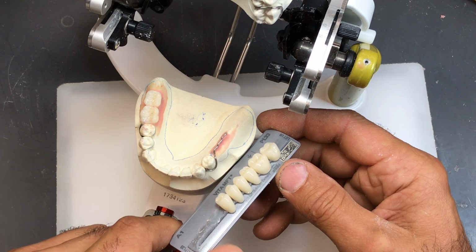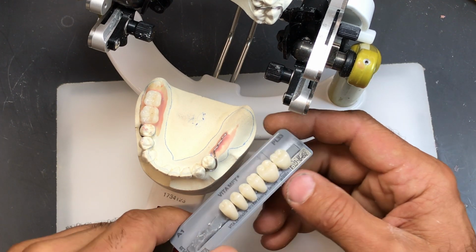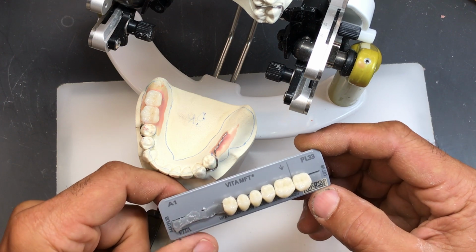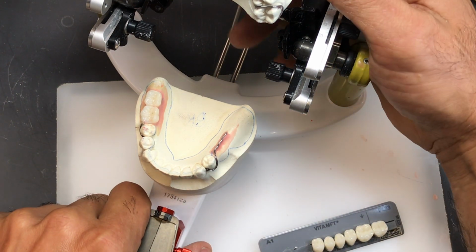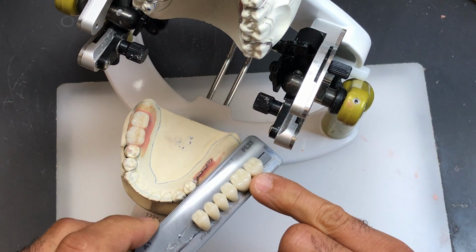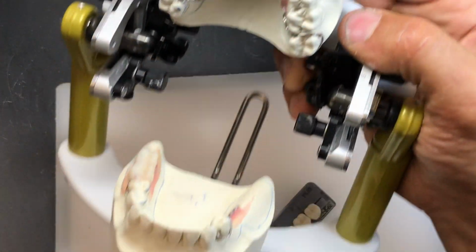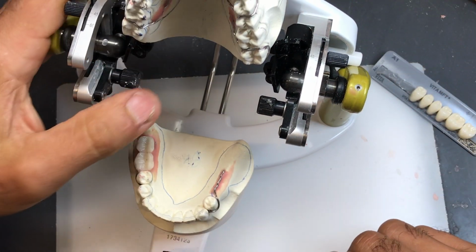So selecting the mold, there's a number of things you got to consider. The size of the mold, obviously, and also the cuspal inclination of the mold. If we look at the cuspal inclination of the mold here, it's fairly shallow. It's got a lot of anatomy, I should say. And that should correspond nicely with the opposing. You're not going to get one that's just absolutely perfect, but something that's very close.